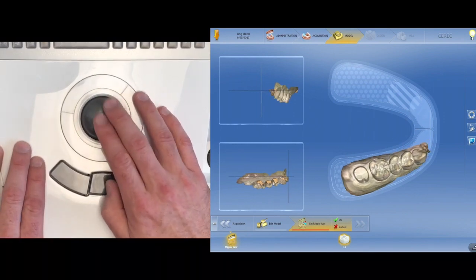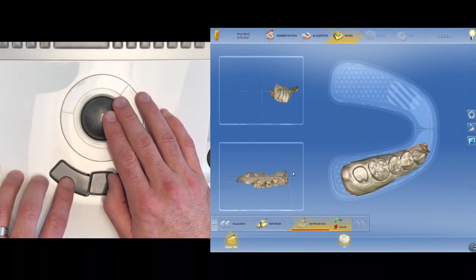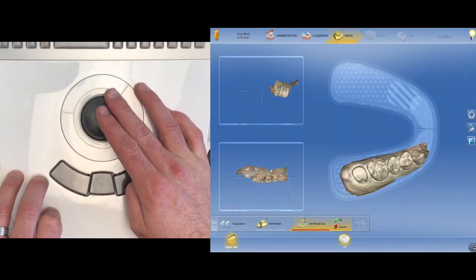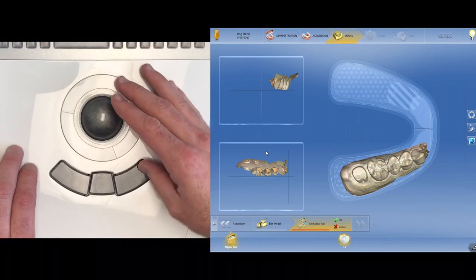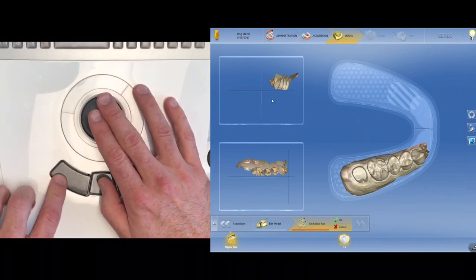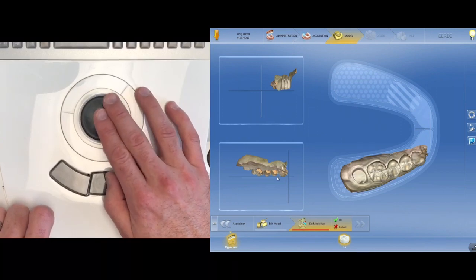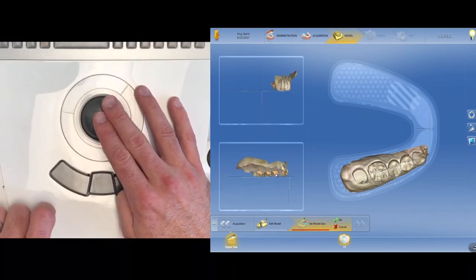Next, I'm going to go to the bottom. You can go to the top first. It doesn't really matter. And I'm going to rotate it a little bit, just a little bit. And then I'm going to pan it up with that right button. I'm using my thumb. Now I'm going to go up here a little bit, and I'm going to grab out here and rotate it down just a smidge. And you can see those cusp tips are pretty much in line, but I'm going to rotate it a little more and then drag it down just a smidge.